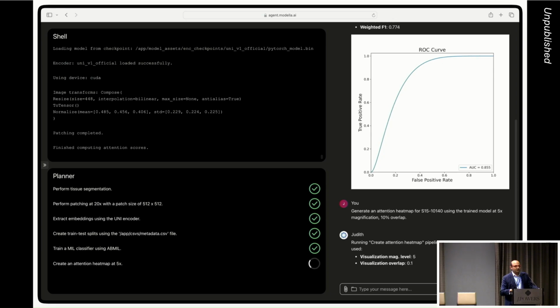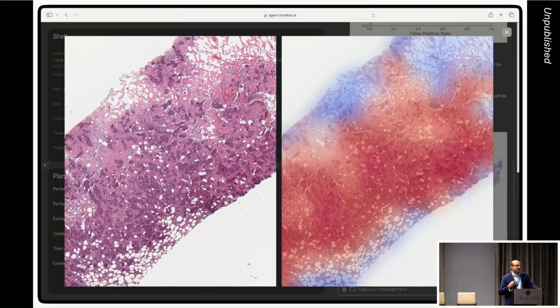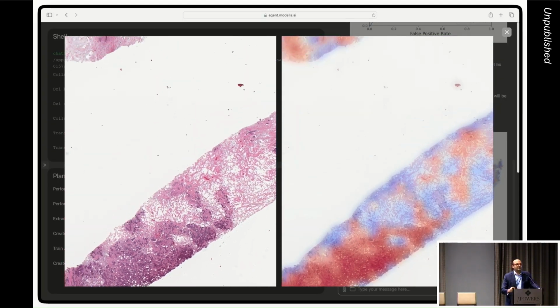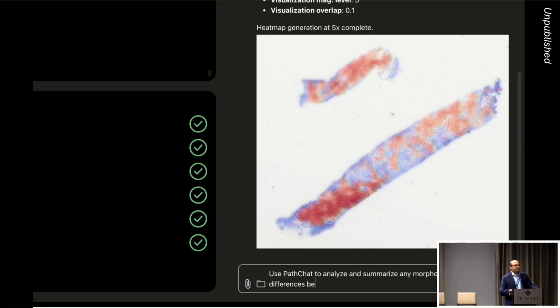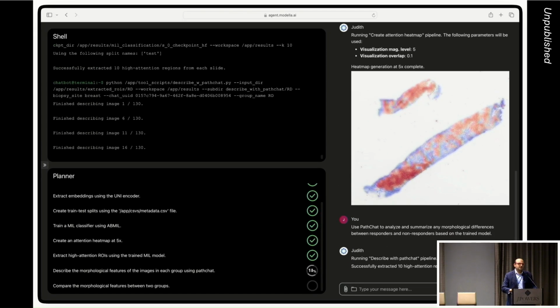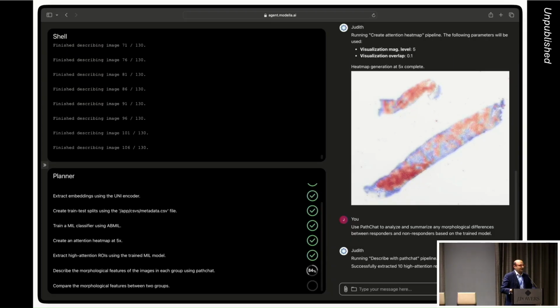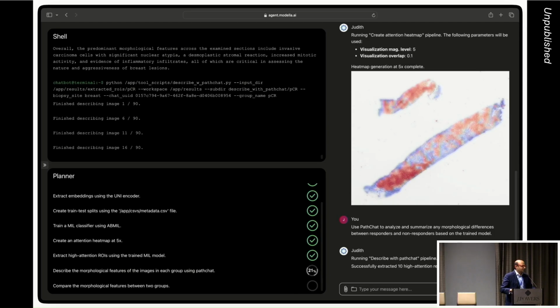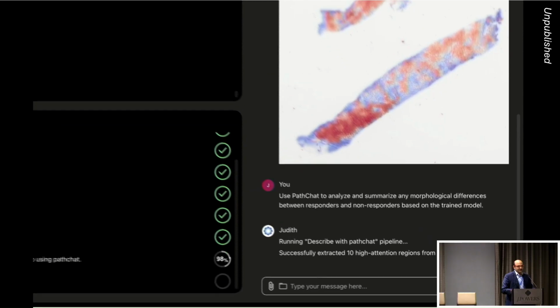You might ask what regions the model is using to make some of those determinations, and it can go in and look at some of those regions, but that's more like reading the tea leaves to get a more deterministic answer for what the model actually used. Maybe you want to look at everything in your test set and see what's common across the high attention regions within all of those images, and then use a generative model to explain it in text. So that's what we do.